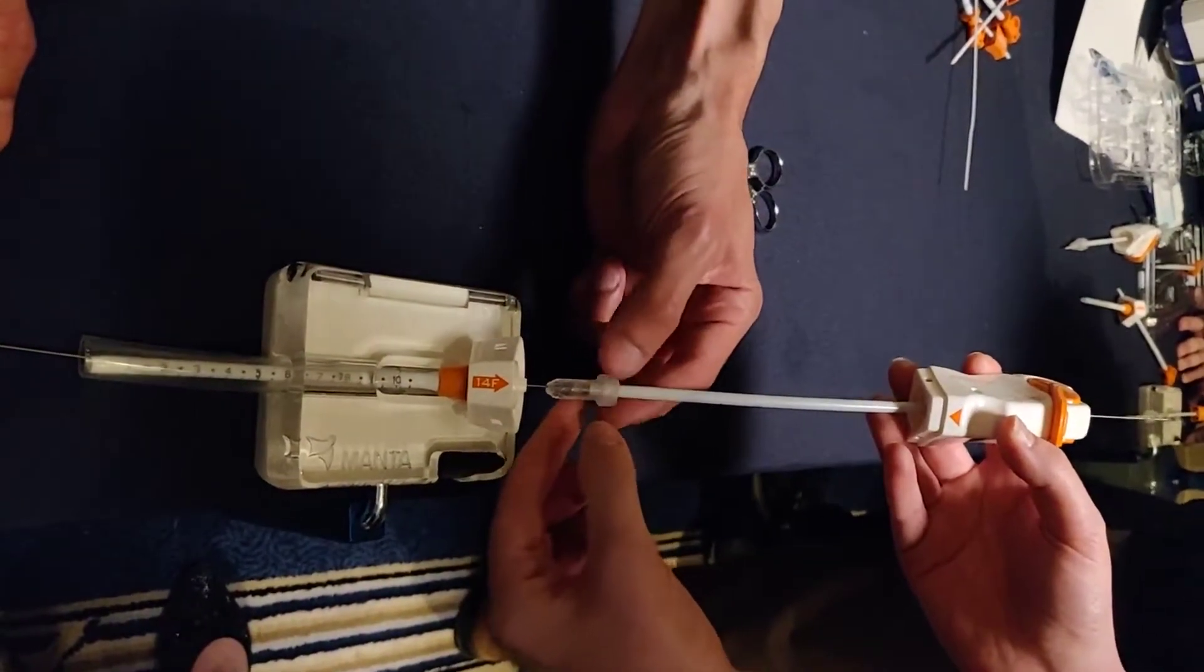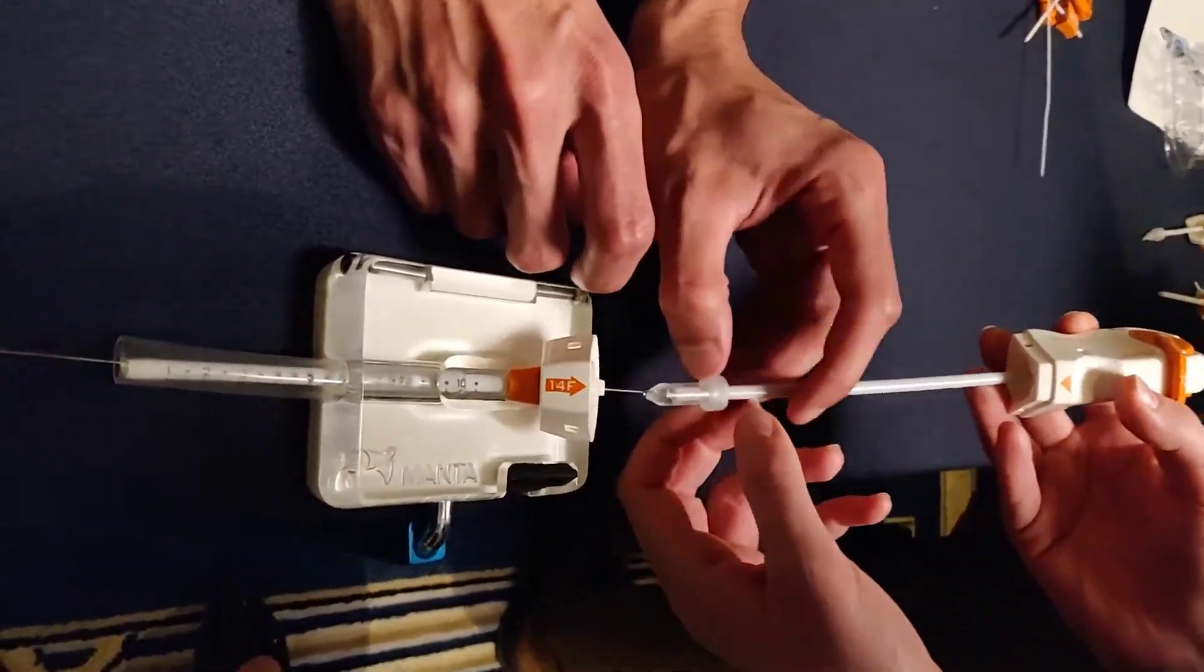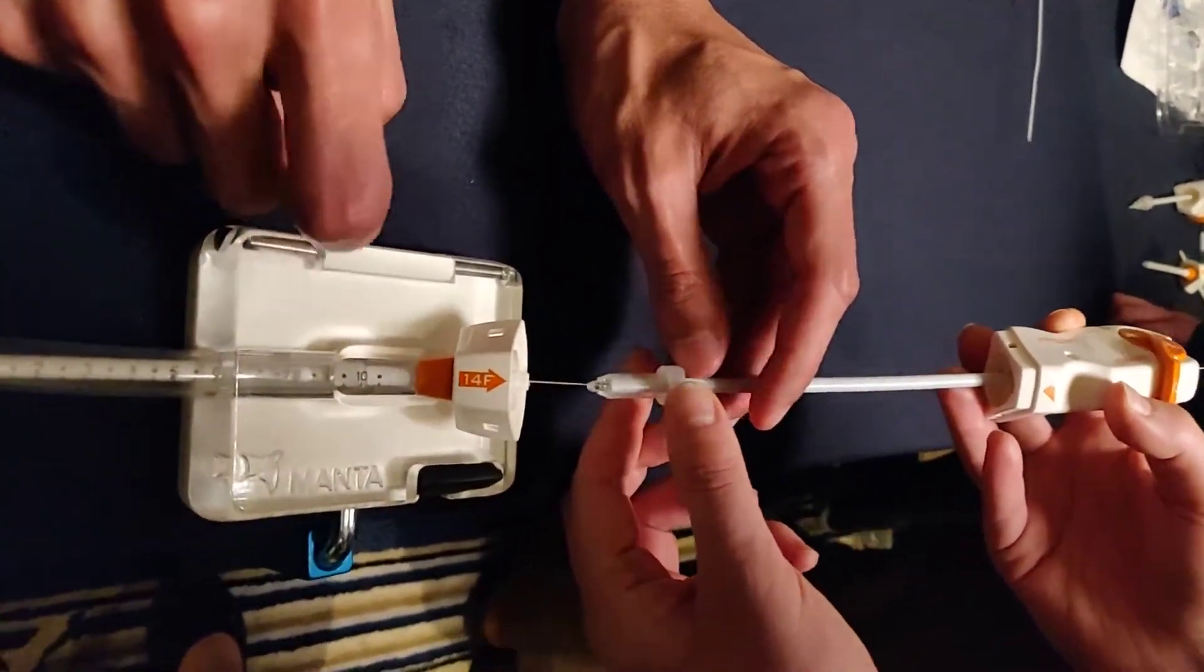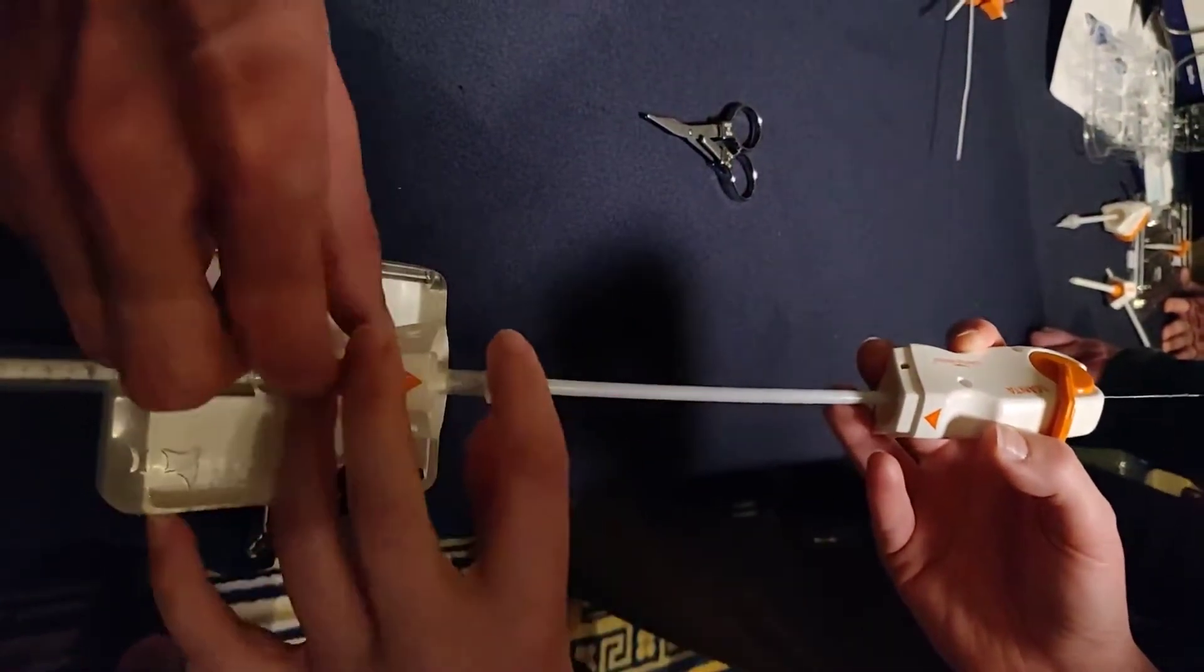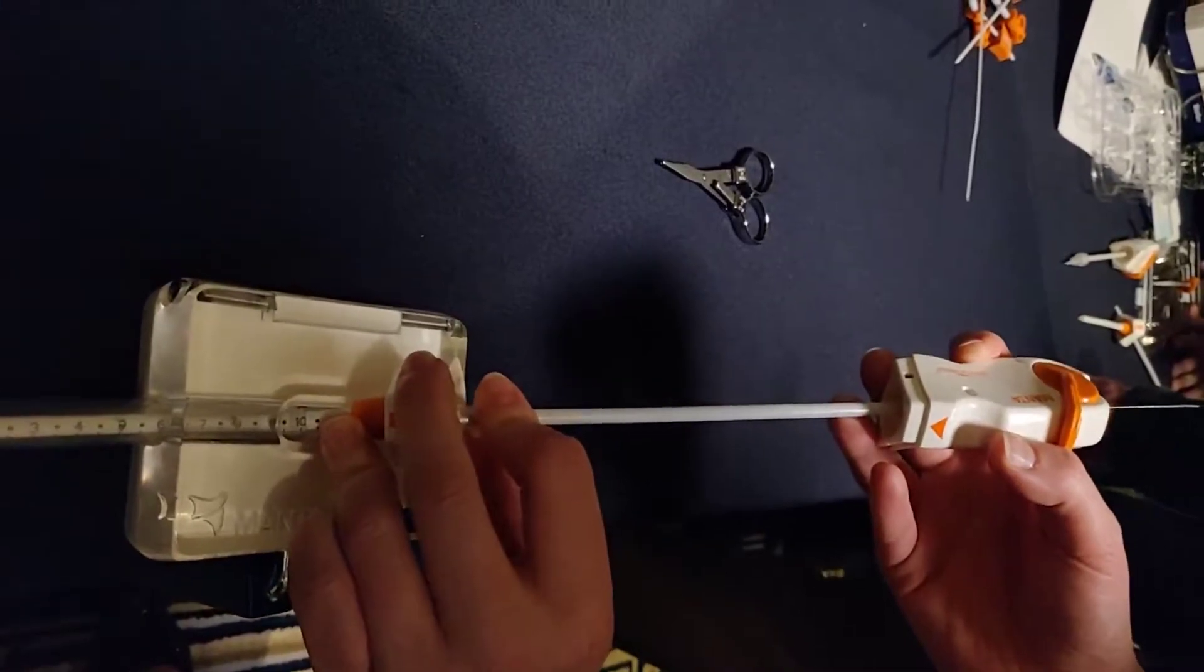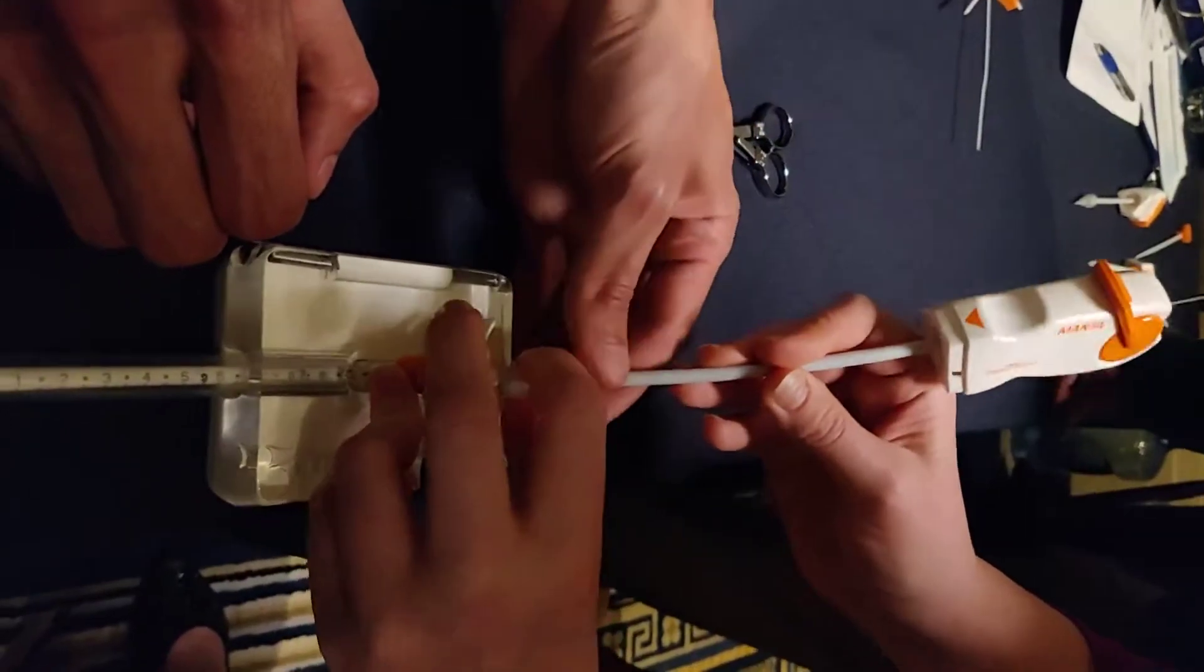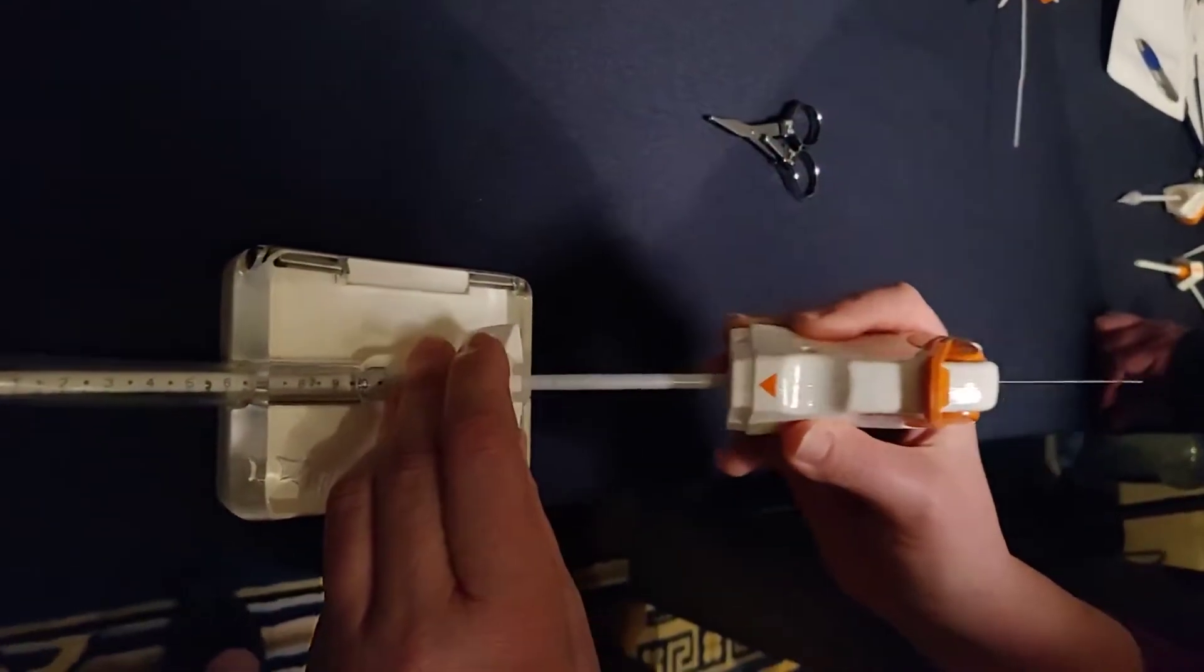Before we insert, this is key. We want to make sure that our anchor is covered. See what happens? It can be exposed and that can do damage to the actual sheath, so we always want to make sure it's nice and covered. Yep, insert that all the way.